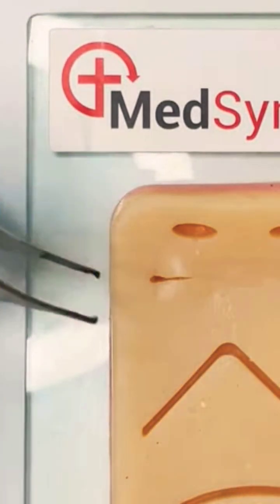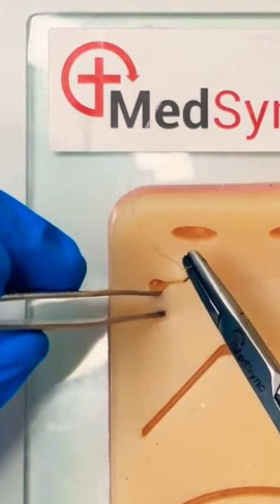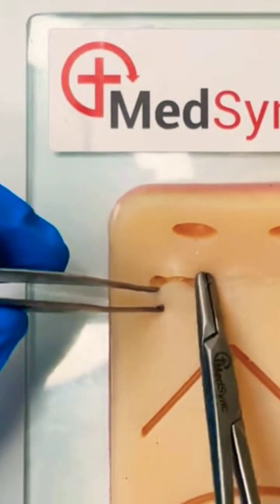If there are small gaps at the end of the wound, you can continue the subcuticular for one or two passes.